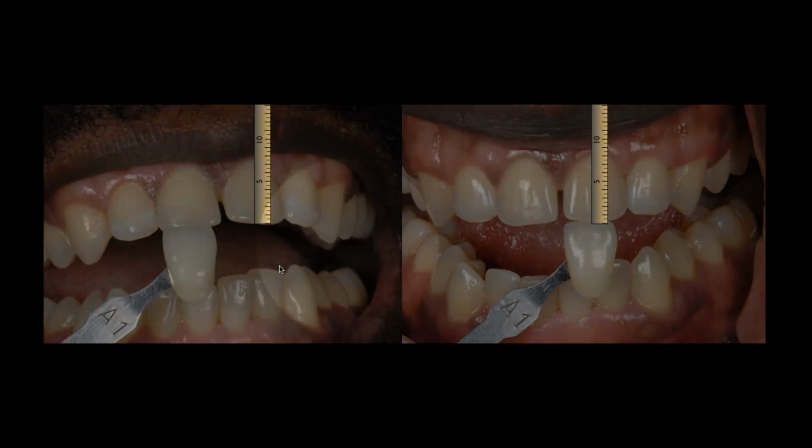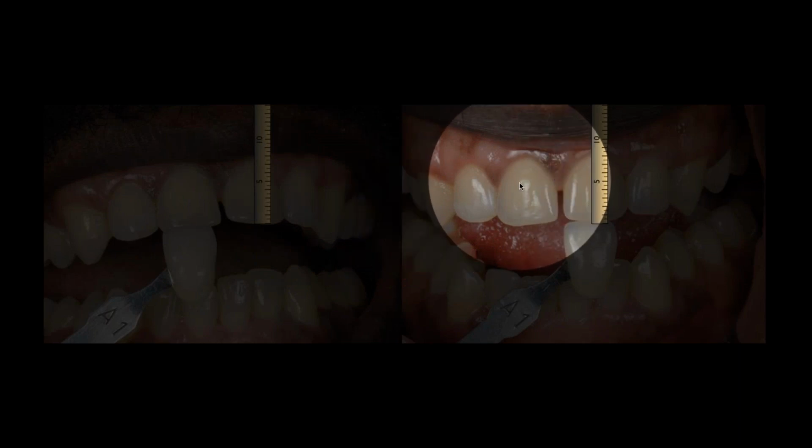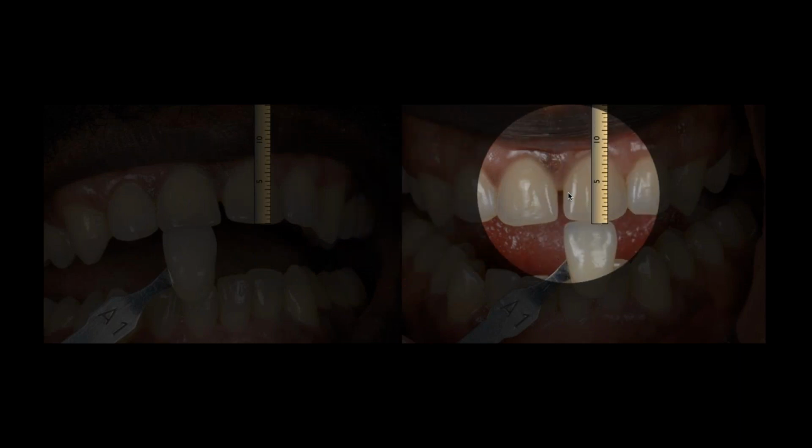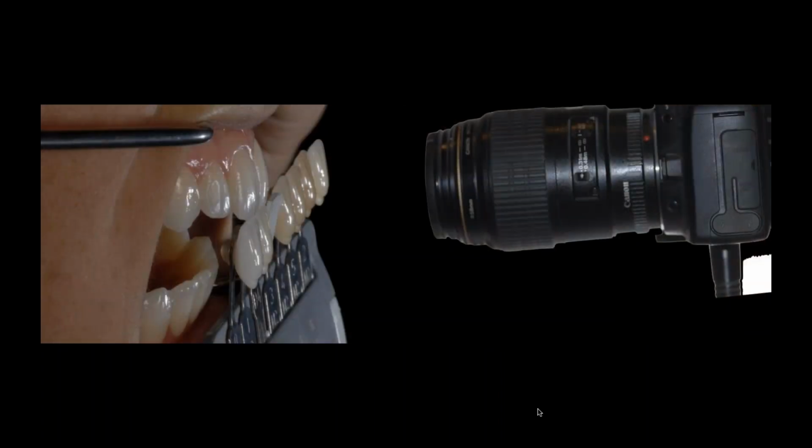The photo on your left is the patient in the dental chair, and look what you see when I'm looking at that tooth. Not only does it look short, but it looks like it has a weird value or warmth of chroma to it. And when I bring it over here to the patient sitting or standing, doesn't the tooth actually look longer, and the coloration actually looks different? So it's really important that the angulation of the photography is worked in there.